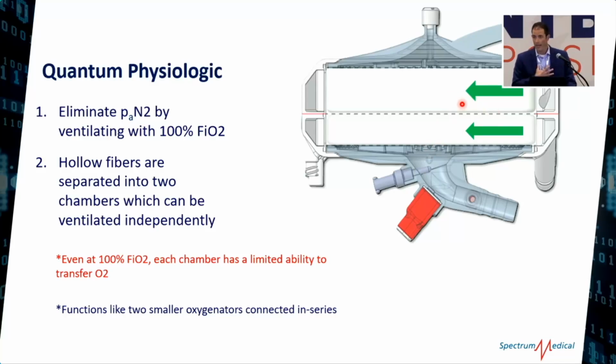It's kind of like a lung that has pneumonia. You're not fully ventilating that section of the lung. Well, we're not fully ventilating a section of the oxygenator. Meanwhile, all the blood goes through all the polypropylene. And by doing so, we allow you to use 100% oxygen, but still keep that post-oxygenator PO2 somewhere between 100 and 200. Everybody with me with that concept so far?